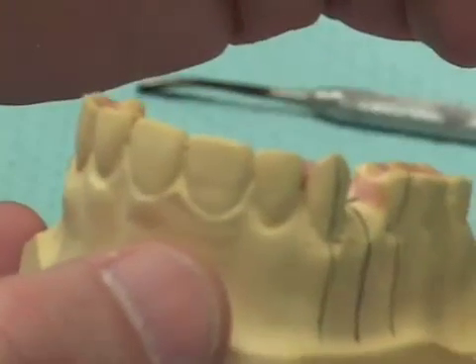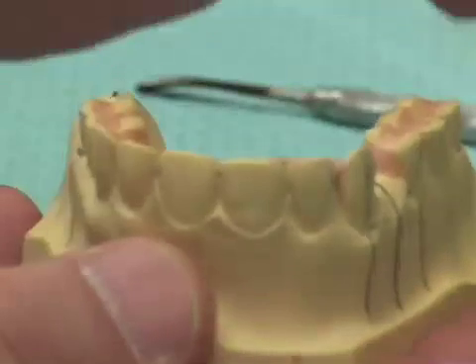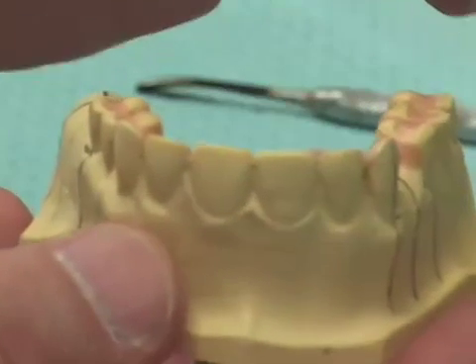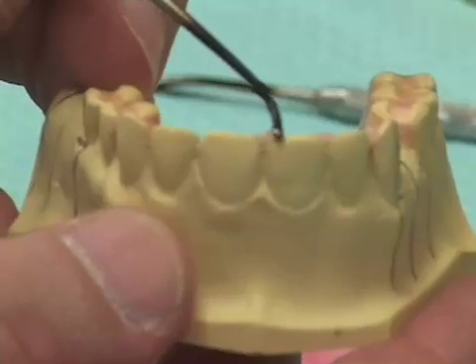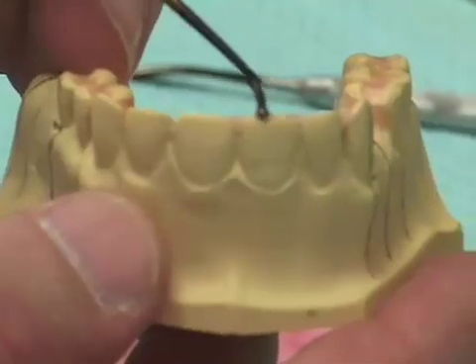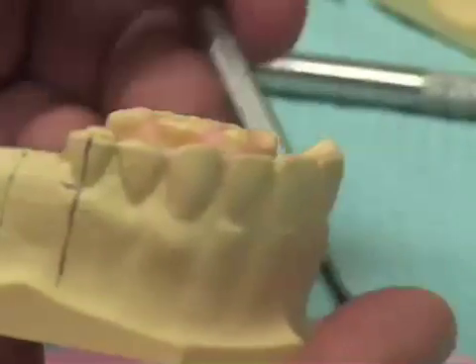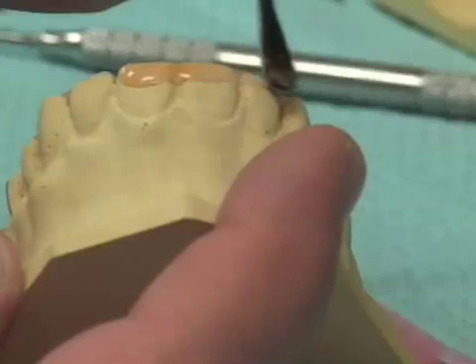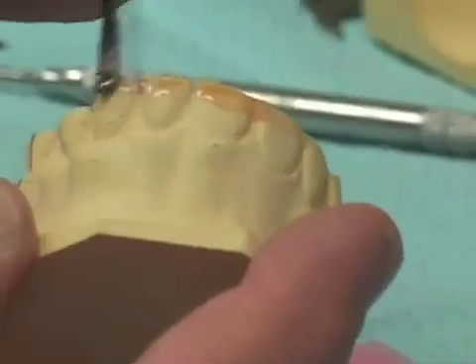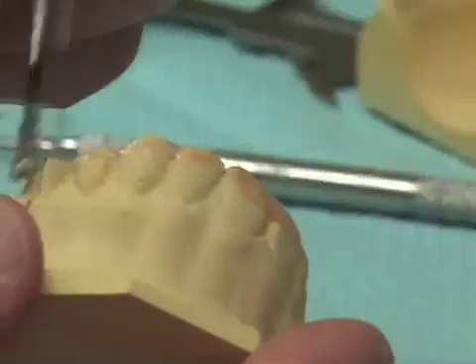Another area that bears attention is right along the incisal edges of the anterior teeth, because where the corners of teeth come together at their incisal edges, it may cause the cast to break. Finally, I take my number seven wax spatula and flow a very thin amount of wax at the labial and buccal of the teeth.